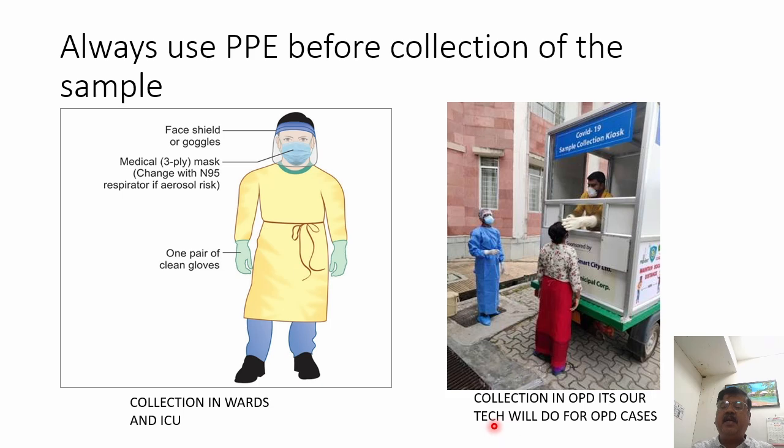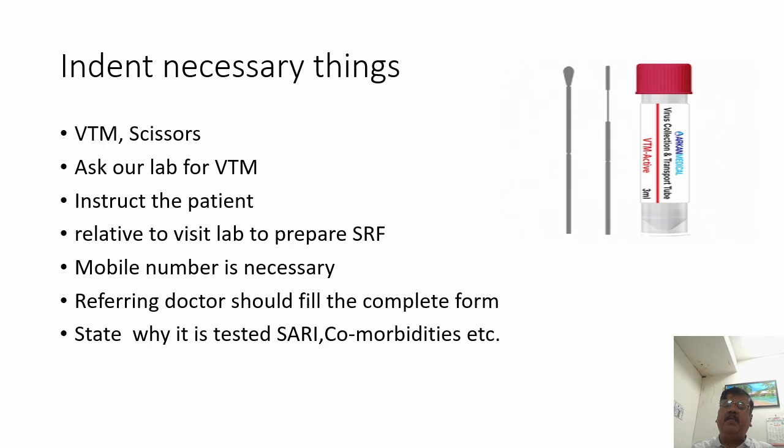During the pandemic, they prepared such kiosks for collection. Here the technician is collecting the specimen from the lady who came for the diagnosis. That can be helpful because it saves changing the PPE each and every time. So a kiosk can also be used. It is available in our OPD, so OPD cases can have samples taken through the kiosk.